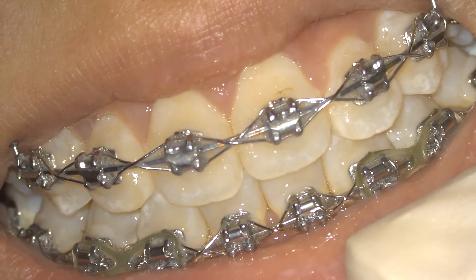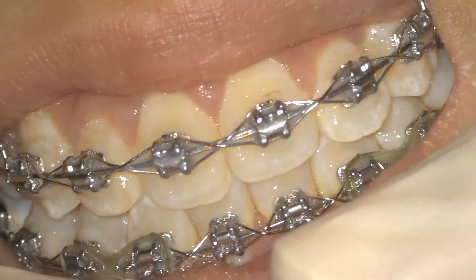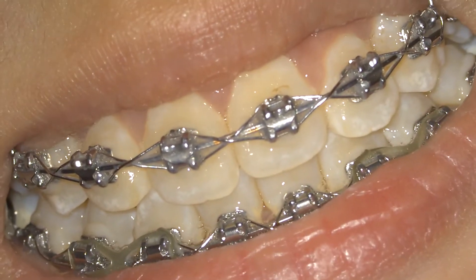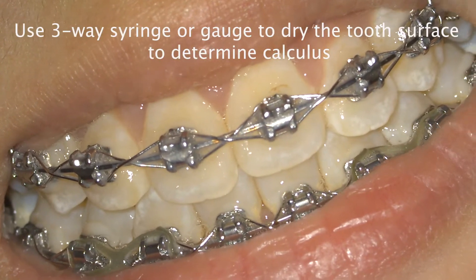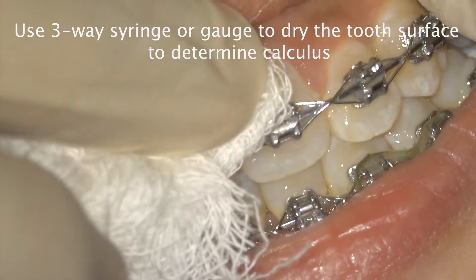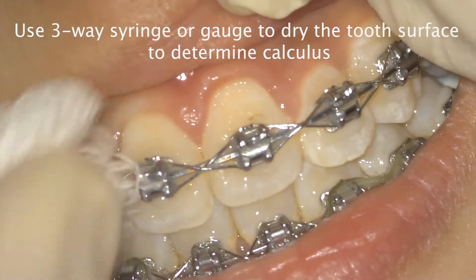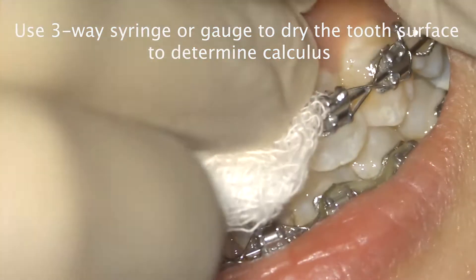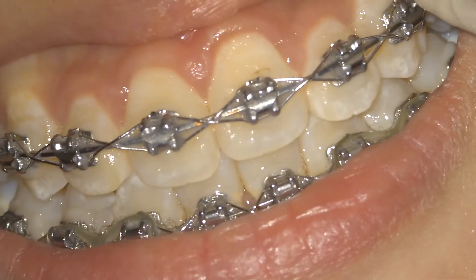Sometimes, with fresh calculus you may not be able to detect it in a very moist environment. In that case, you can use your three-way syringe and dry the area, or you can even use your gauze and dry the area to see if there is calculus present visually.